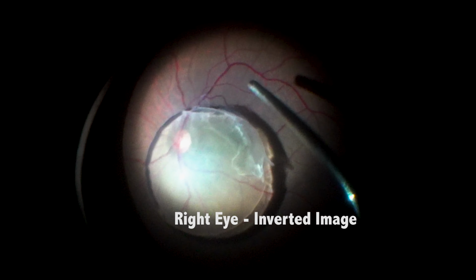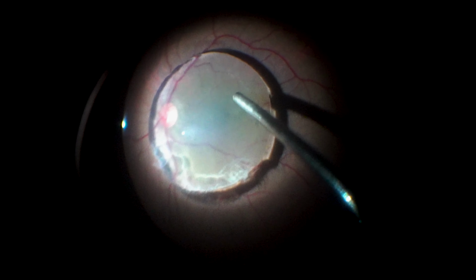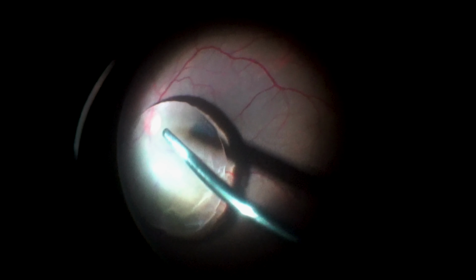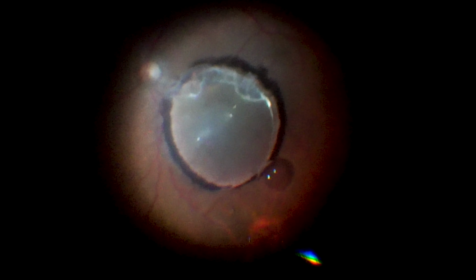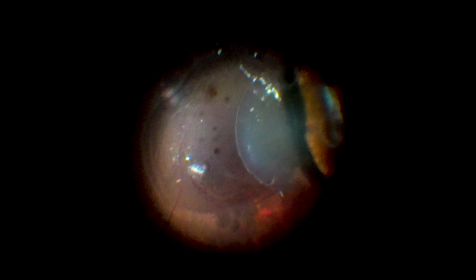The lens was transparent enough to allow visualization from the fundus, but in an attempt to protect the retina, we decided to inject perfluorocarbon to lift it up. It is perfluorocarbon liquid time now, but notice that it came with multiple bubbles that coalesced as one after a while. In this way, the lens was kept away from the macular area.